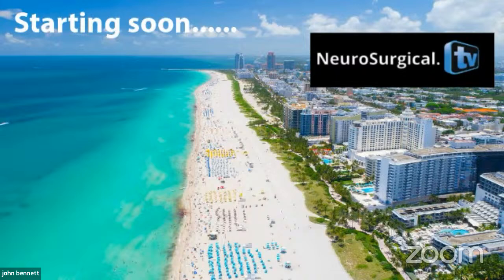And I initially thought this is an anterior petrosal meningioma. You can see it's anterior to the IAC. I thought maybe a simple retrosigmoid approach would be adequate. But again, this is what I saw intra-op. You can see the tumor is in front of the seventh nerve. The tumor was firm. It was not very soft and suckable. And it was very challenging working with the tumor in front of the seventh nerve.